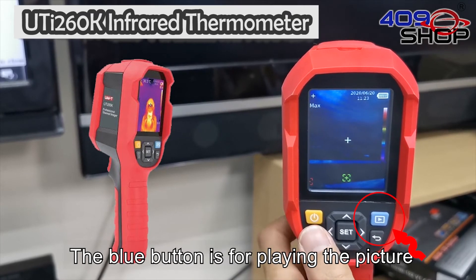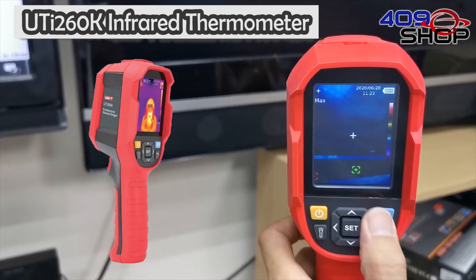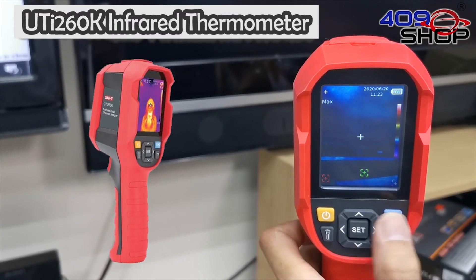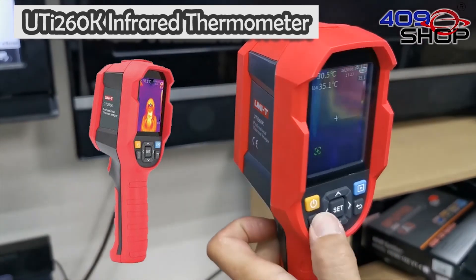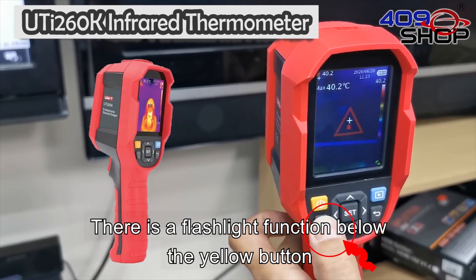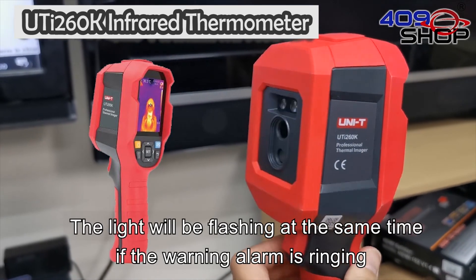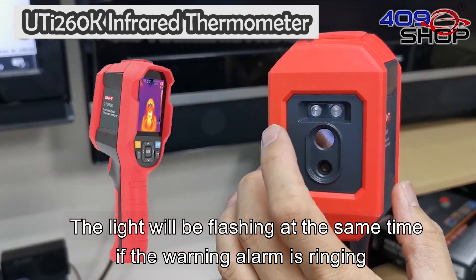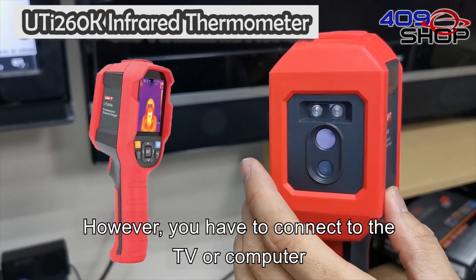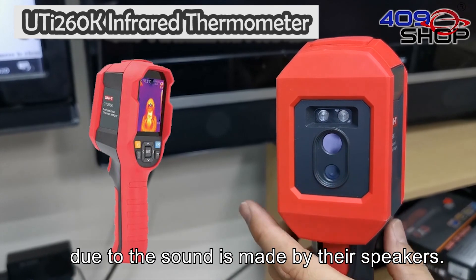The blue button is for playing back pictures. There is also a flashlight function below the yellow button. The light will flash at the same time if the warning alarm is ringing. However, you have to connect to the TV or computer since the sound is made by their speakers.